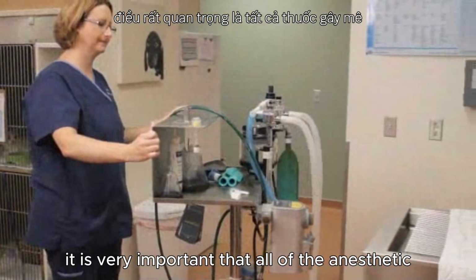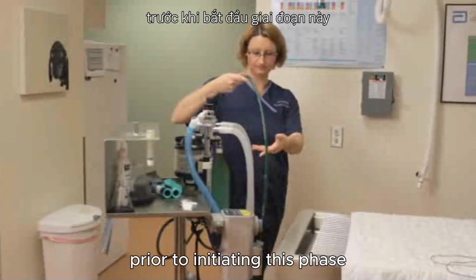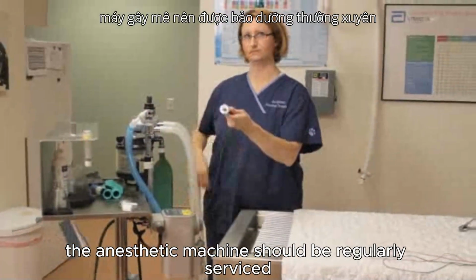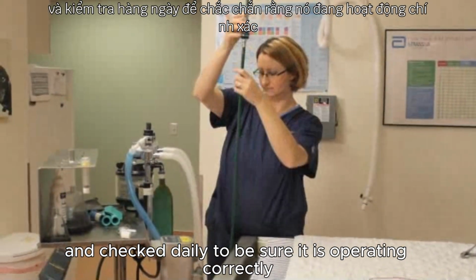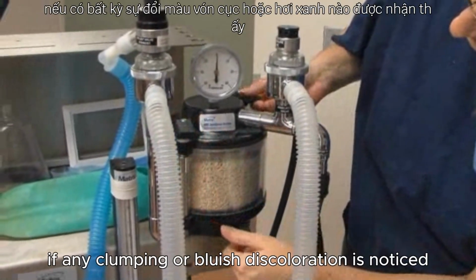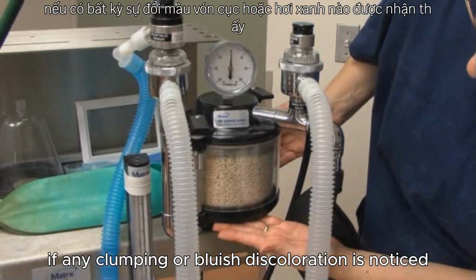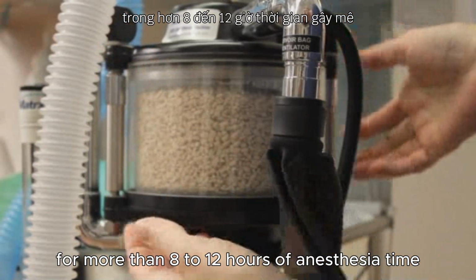It is very important that all of the anesthetic equipment is checked and ready for use prior to initiating this phase. The anesthetic machine should be regularly serviced and checked daily to be sure it is operating correctly. The carbon dioxide absorbing material should be checked and replaced if any clumping or bluish discoloration is noticed, or if it has been used for more than 8 to 12 hours of anesthesia time.